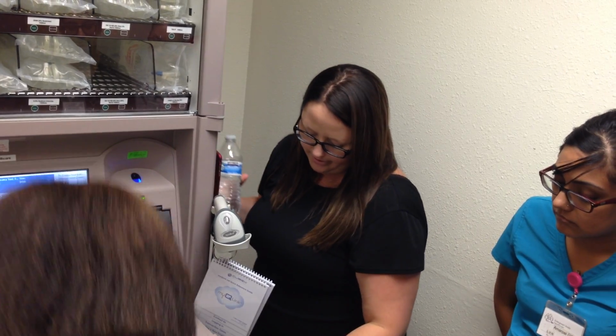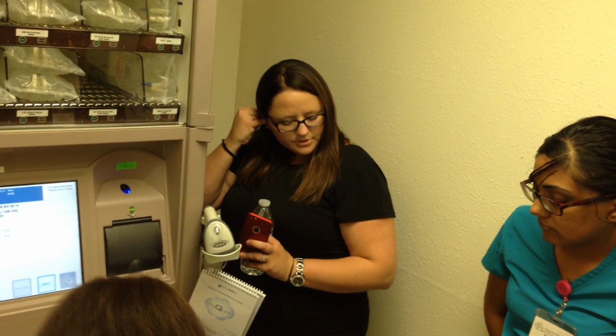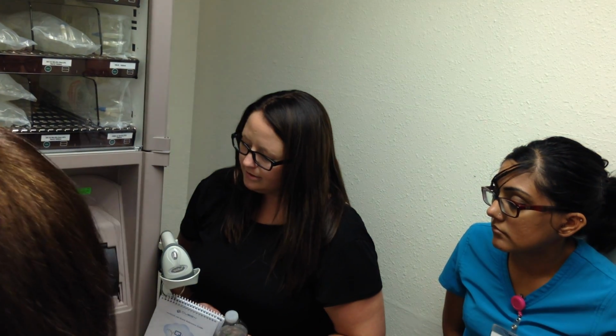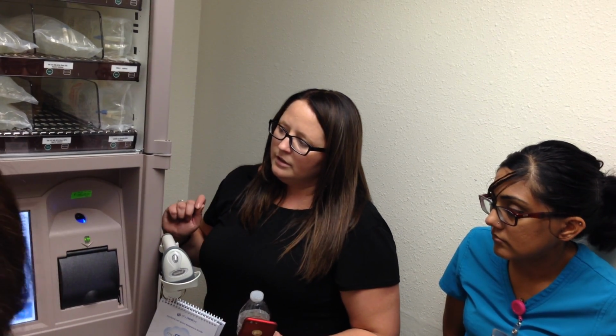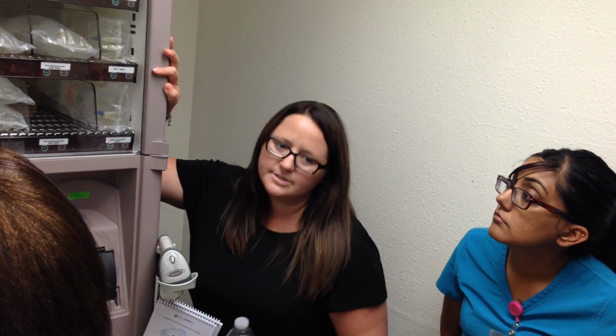Okay, so we'll take one out, close the lid, and then close the drawer. All right, and then you'll hit next. Okay, so this is going to come unlocked, and then the appropriate spot is going to flash. So it's really quiet. I was trying not to talk during it because sometimes you can hear it. Usually I just talk right over it and then no one hears it. When you're here by yourself, you'll probably hear the click. It's very subtle. It doesn't make a lot of noise, and it doesn't pop open at you automatically like some of the older machines do.